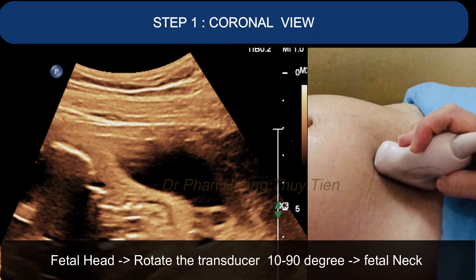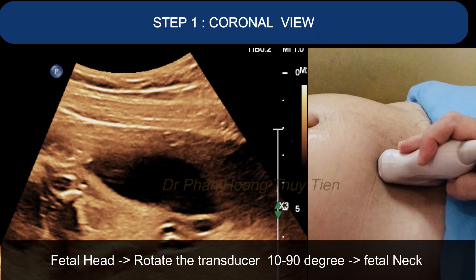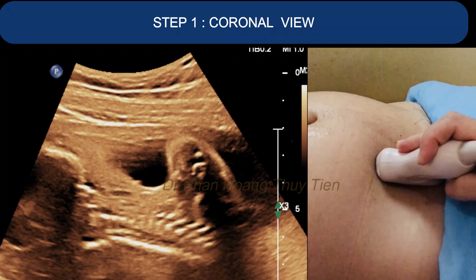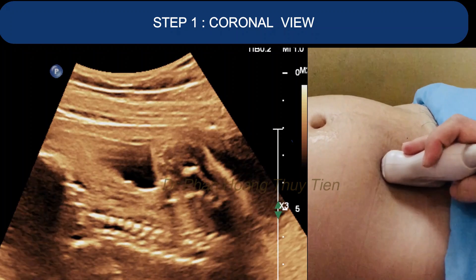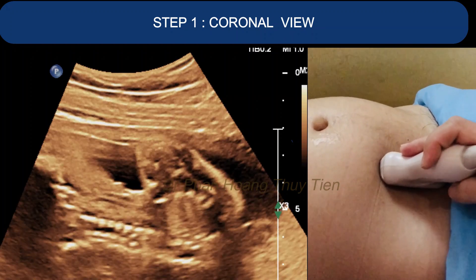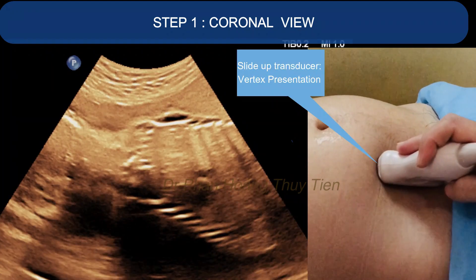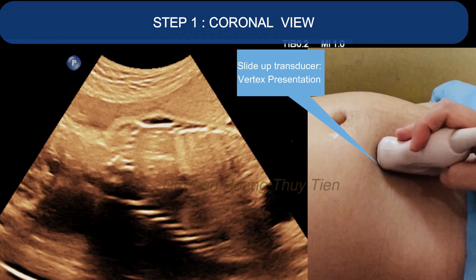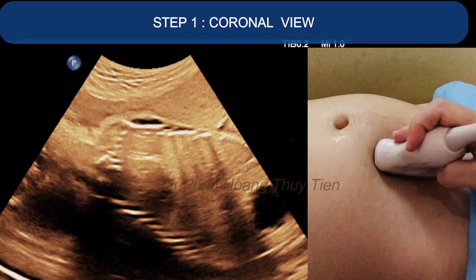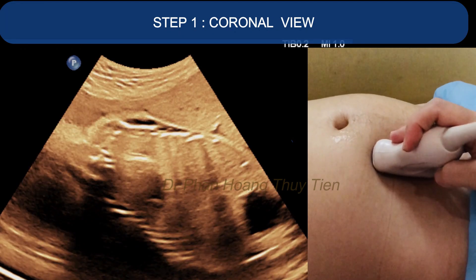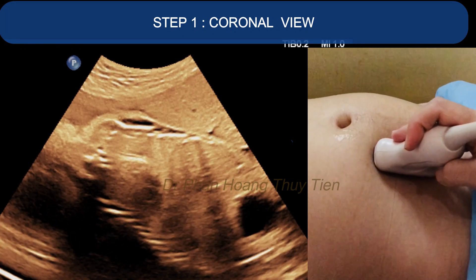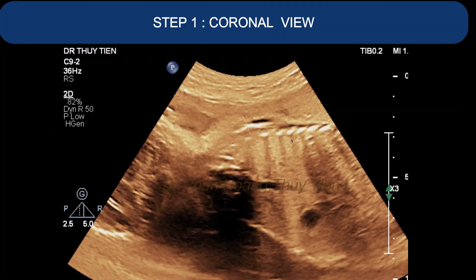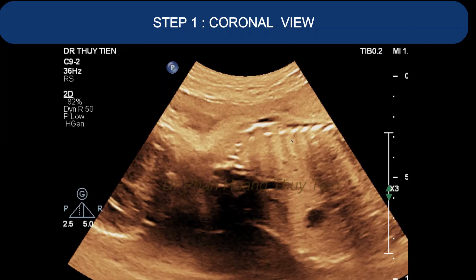Step 1 — coronal view: you first identify the fetal head, then rotate the transducer 10 to 90 degrees to get the fetal neck position. Then you will sweep the transducer downwards from the fetal neck along the spine to obtain a clear coronal view of the fetal. Please be aware that the fetal neck is on the left side of the observer on the video screen.